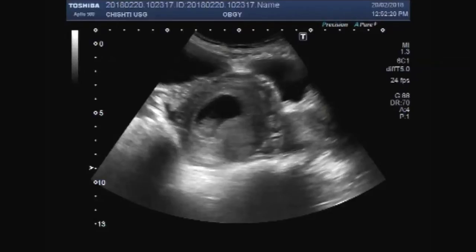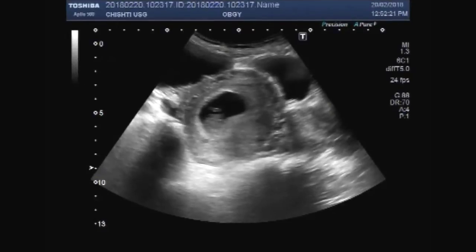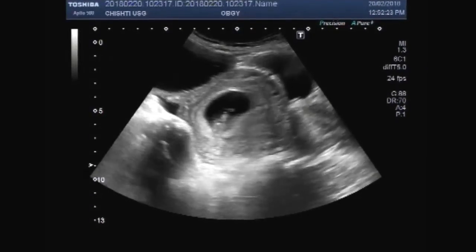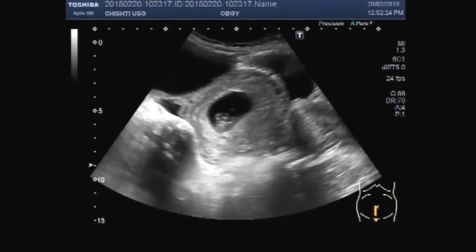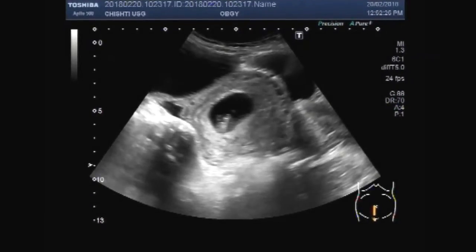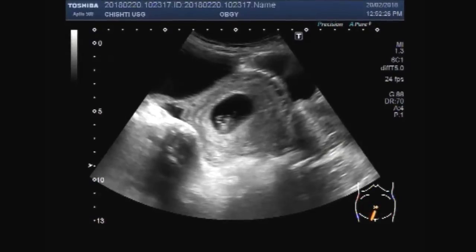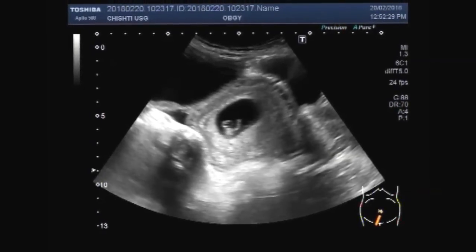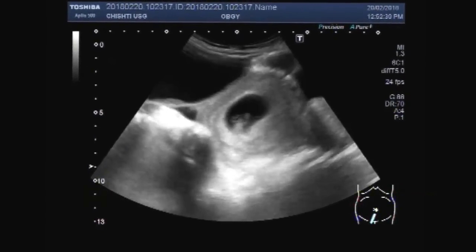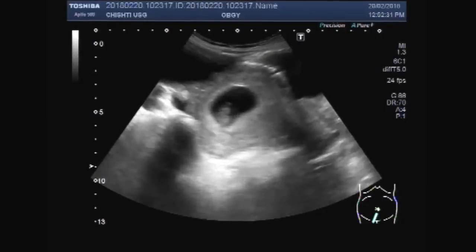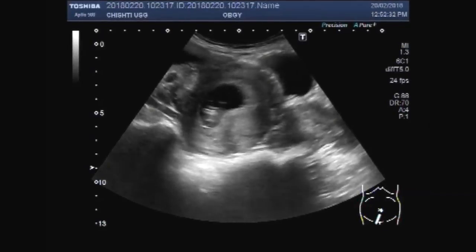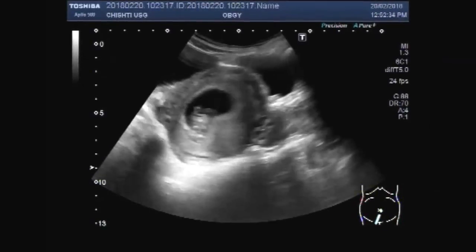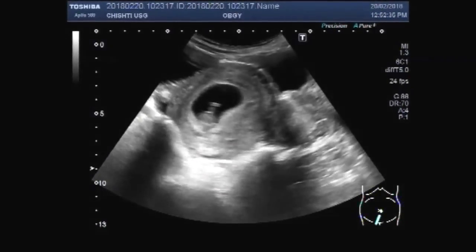You can see the uterus and a small fetus seen in the gestational sac. Fetal movements are also visible.